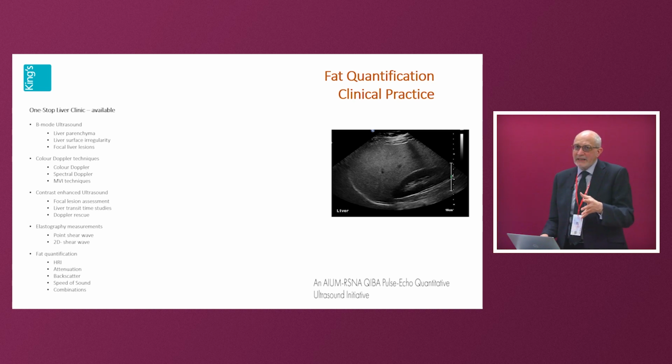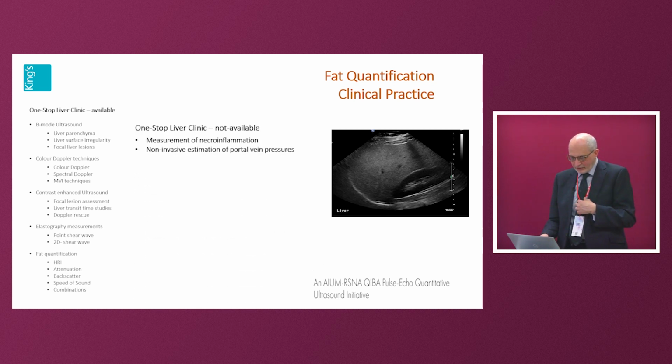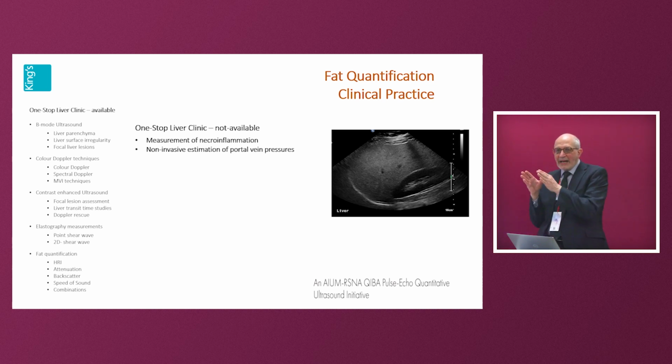So what are you missing from your comprehensive liver ultrasound examination? Measurement of necroinflammation. This is the old NAFLD going to the NASH. You can't tell this on your ultrasound. You can't tell there's inflammation. Some other parameters like liver biopsy can. But this is changing. This is coming. The measurement of viscosity in the liver will tell you whether there's necroinflammation or not.